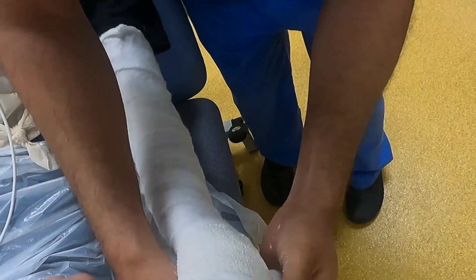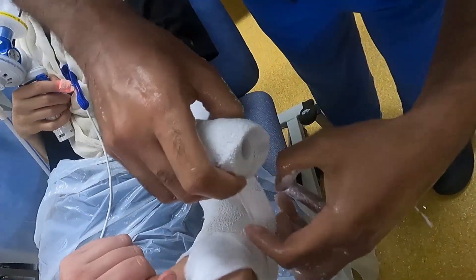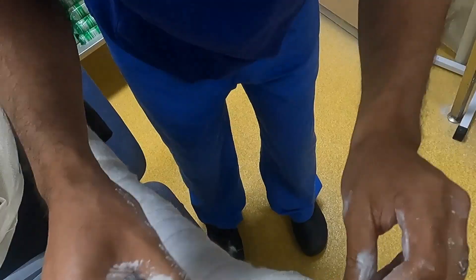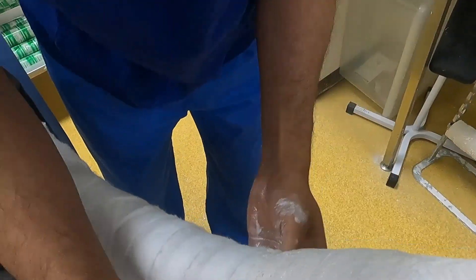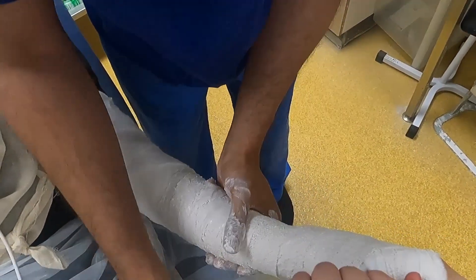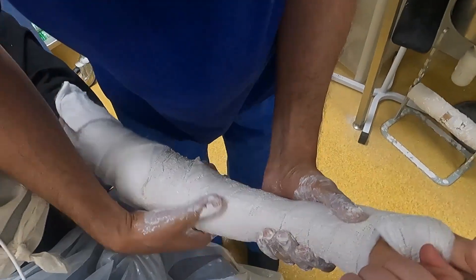The first layer of plaster of Paris is applied circumferentially, taking great care not to extend the plaster distal to the MCPJs. In this case a complete cast was applied, making sure that this is not applied too tightly as iatrogenic compartment syndrome can develop.